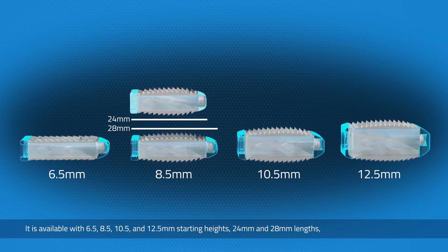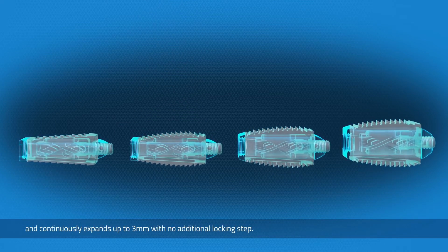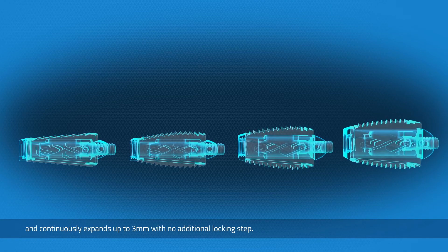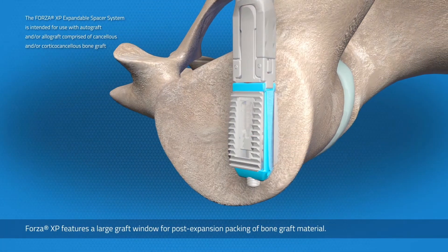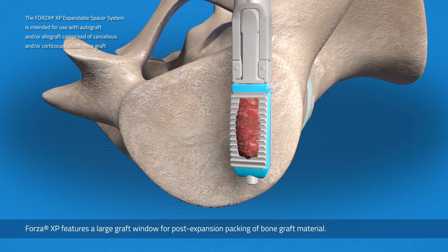It is also available in 12.5 mm starting heights, 24 and 28 mm lengths, and continuously expands up to 3 mm with no additional locking step. Forza XP features a large graft window for post-expansion packing of bone graft material.